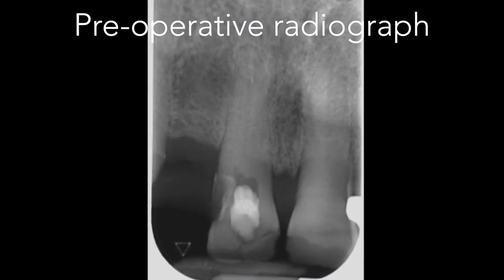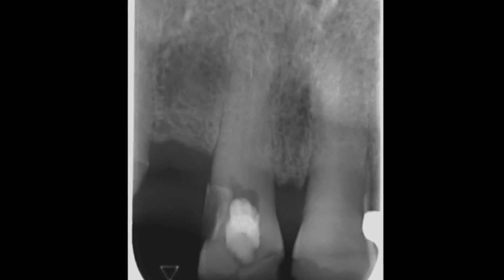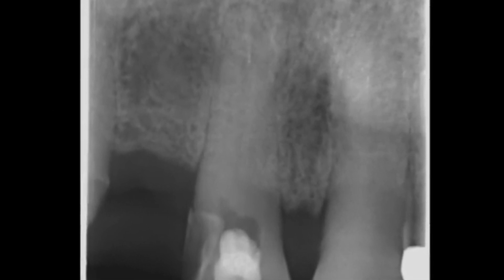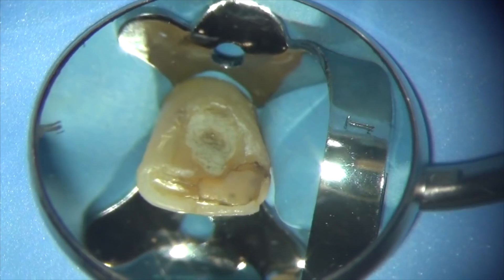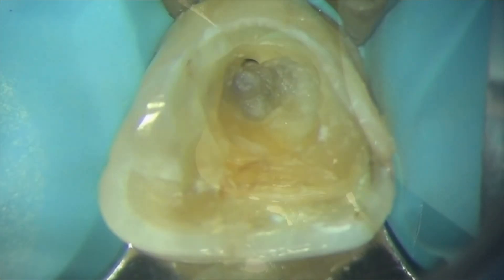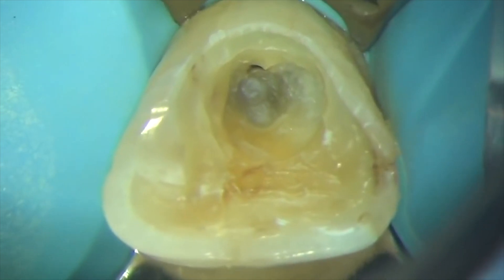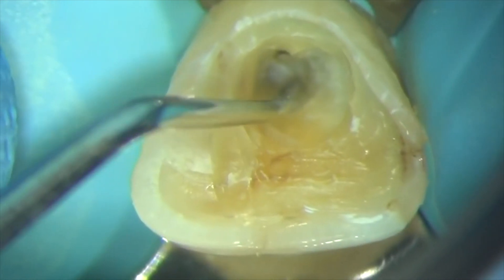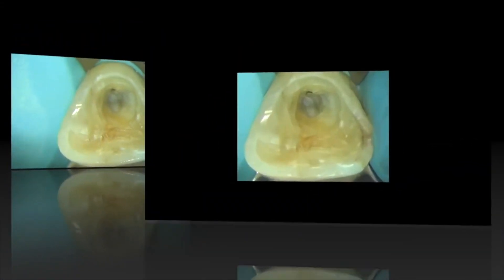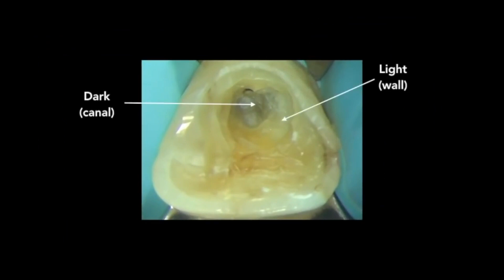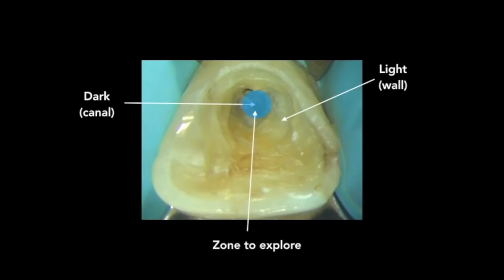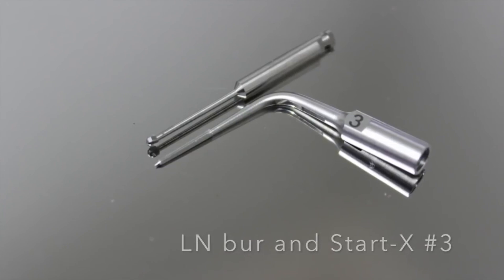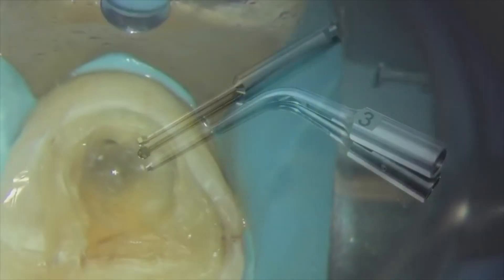So in this case we have a similar situation: the maxillary central incisor is heavily restored with composite and a huge access cavity has been created in trying to find the sclerosed root canal. The temporary restoration is simply removed with a long tapered diamond burr. With the temporary removed, we're now looking under high magnification into the access cavity and we can see two layers of dentine — a dark layer where the sclerosed root canal lies, and a lighter layer which is the wall. I'll be using a combination of an LN burr and the Satelec 3 ultrasonic tip to remove sclerosed dentine and locate the orifice of the root canal.